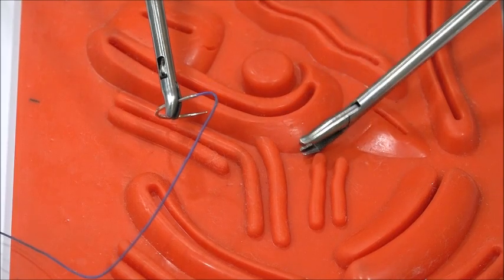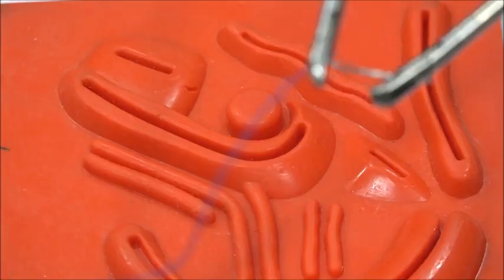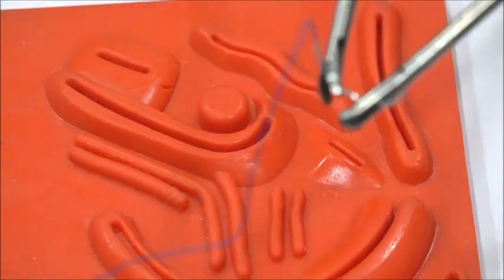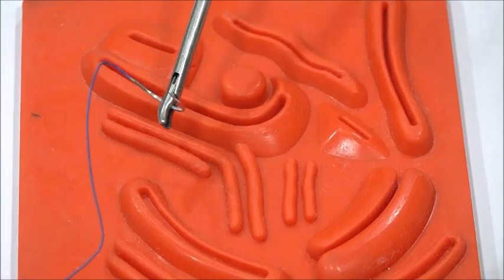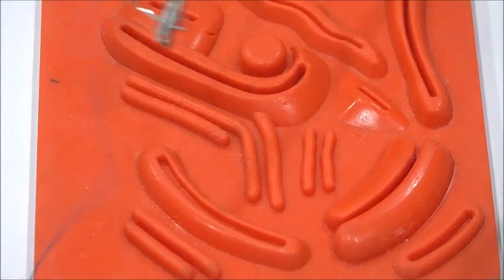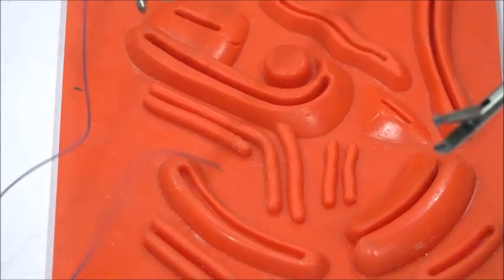At needle loading, as I have discussed, we'll grasp at point C and the needle direction should be 90 degrees to the needle holder.